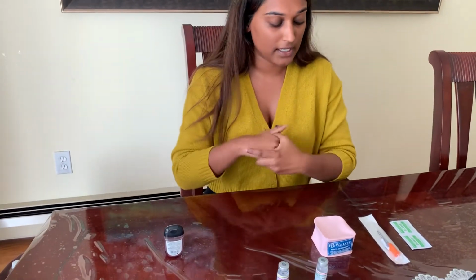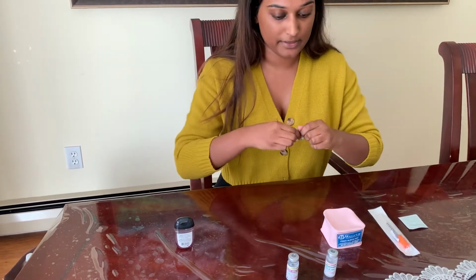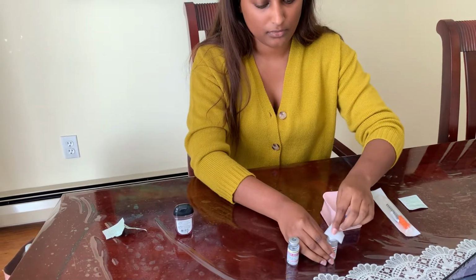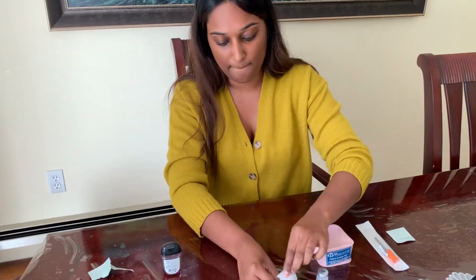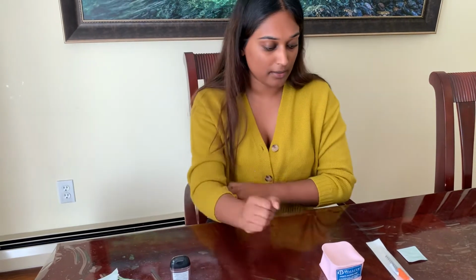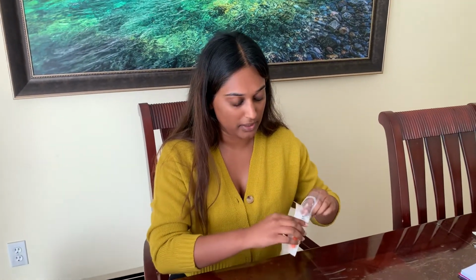And after I sanitize, I'm going to rip one of my alcohol pads and wipe down my vials. Okay, now that that's done, I'm going to take out my syringe.